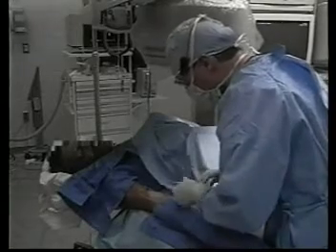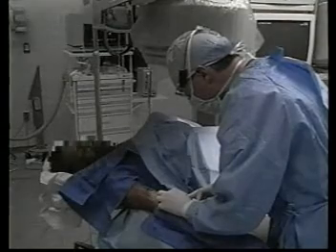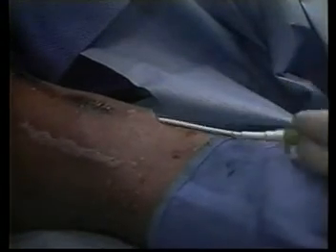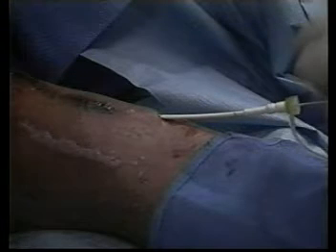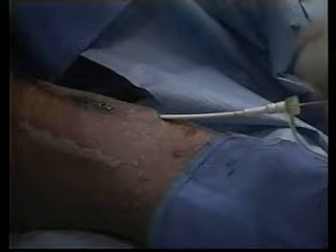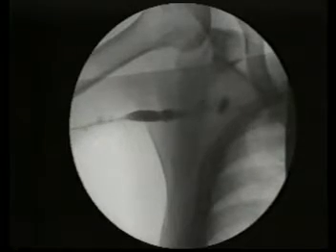After prepping and draping the patient, perform a skin wheal at the anticipated venous sheath puncture site. An introducer sheath is directed toward the venous anastomosis. A larger sheath may be required when additional procedures such as angioplasty or stent placement are performed. Under fluoroscopy, the native vein is assessed for existing central and venous outflow stenoses.